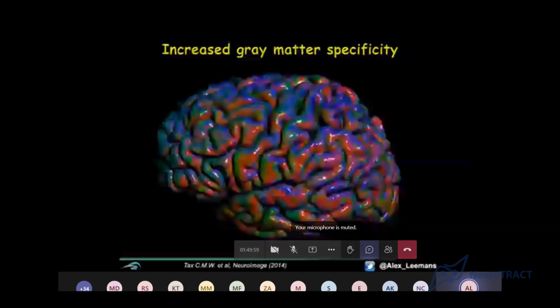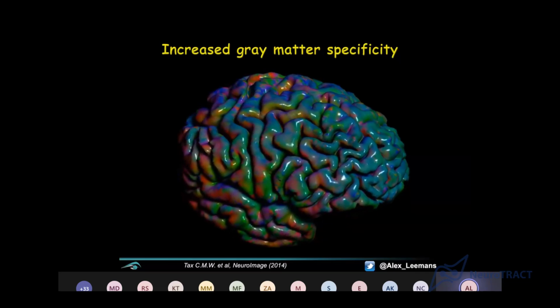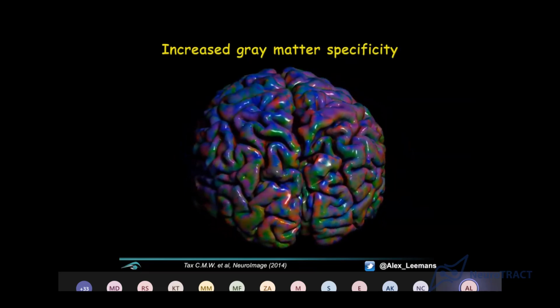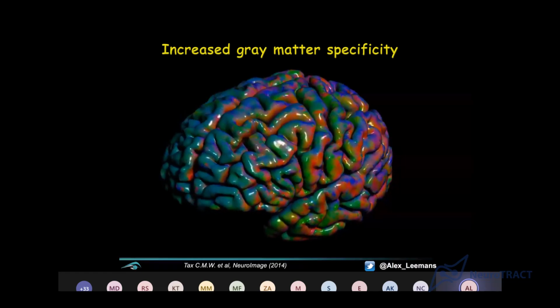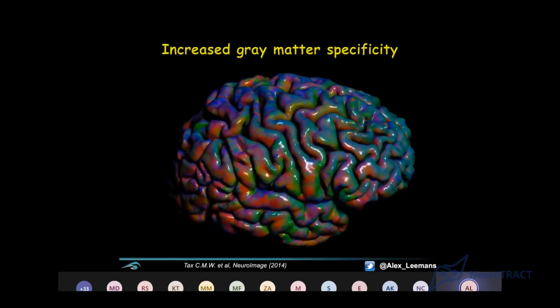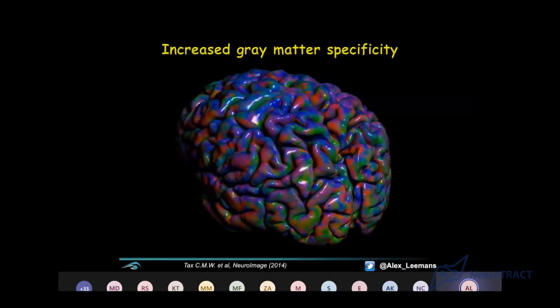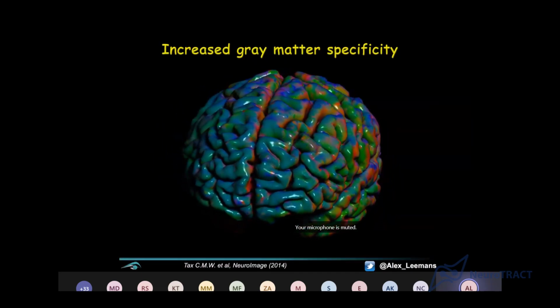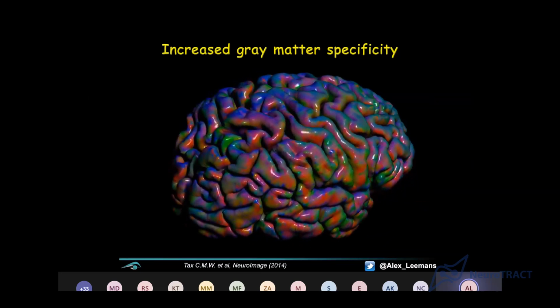But other scanners, clinical scanners nowadays as well. You've got multi-band and all these acceleration techniques to speed up the acquisition, which you can then trade in for higher resolution. I mean, trade is the name of the game in MRI, right? If you want to acquire quicker, then you unfortunately need to get bigger voxel sizes or stuff like that. So you always need to trade off properties of an image. Well, nowadays, high resolution cortical information can be obtained, and you can investigate this.